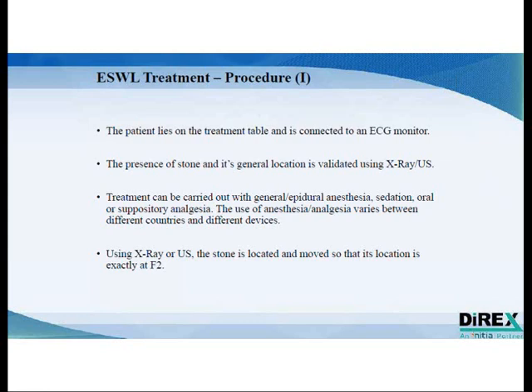Once the stone is located, it has to be placed at the focal point F2, so you have to change the position of the patient in the XYZ in order to make sure that the stone is located at F2 with respect to the generator, which is not moving.